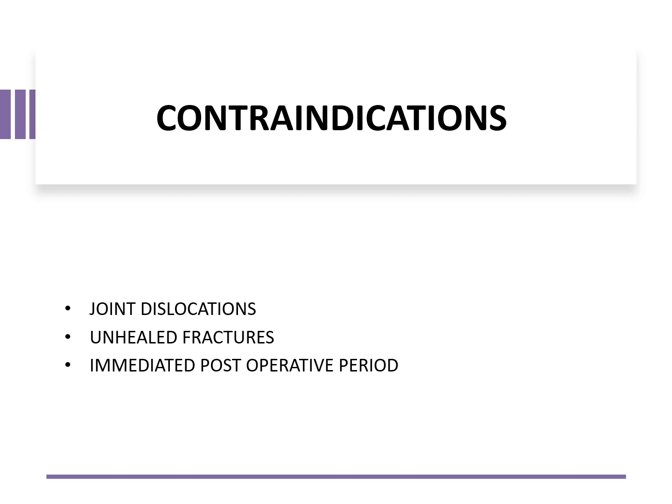As soon as the patient has undergone a surgery, you should not do goniometry because of obvious reasons of pain and discomfort. Any pain and discomfort will lead to improper or incorrect readings, and you should not mobilize the sutured site. So these are the contraindications where you are not supposed to do goniometry.